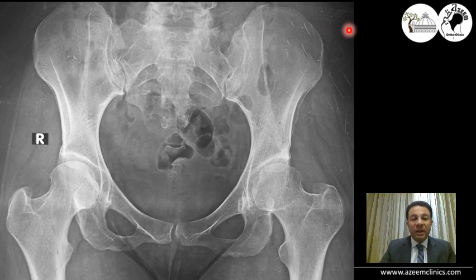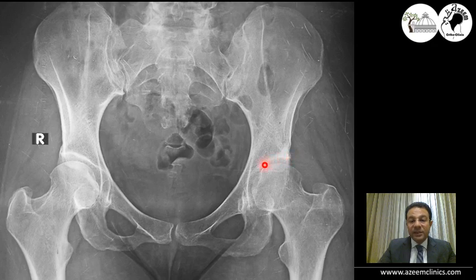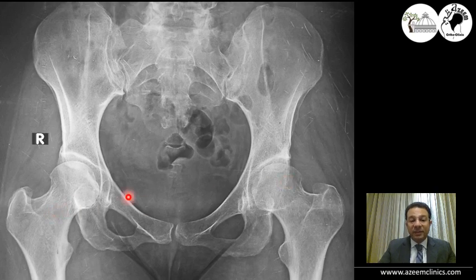This is another X-ray of a female patient, a young adult complaining of chronic hip pain for a long time. At first look you can notice the hips appear quite fine. But if you go and measure the angles, you will find that the dome is opened laterally with a positive acetabular index more than 10 degrees. And if you look at the extrusion index of the head, about 40% of the head is uncovered bilaterally. That's a case of a commonly missed diagnosis — what we name borderline hip acetabular dysplasia.